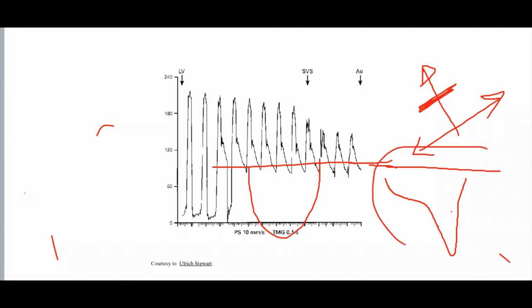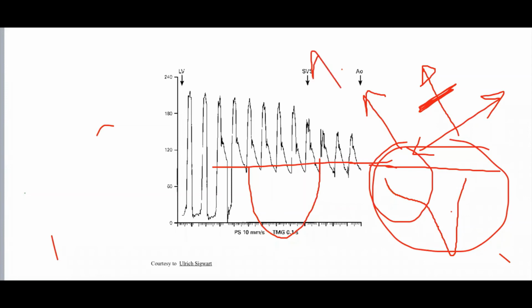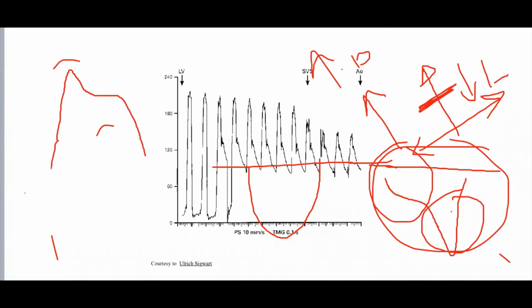What does this do when it comes to the pressure? The initial slow velocity will generate high pressure. And this part of high velocity, the pressure will be low. So I have an initial flow, which is high pressure, and a second flow of low pressure. That's why I have this spike indicating high pressure and dome indicating low pressure, because of changing velocities from early, mid to late systole.